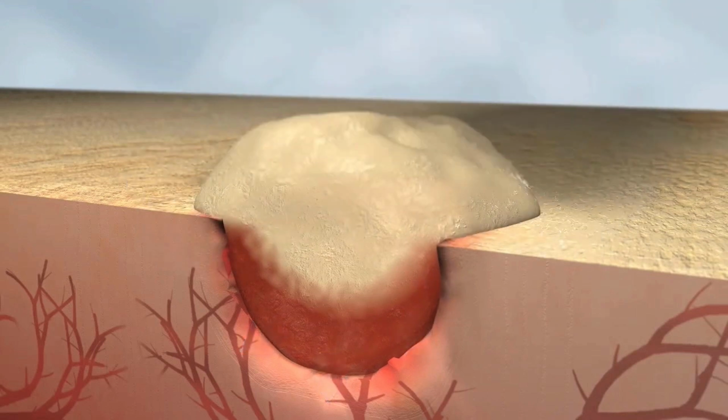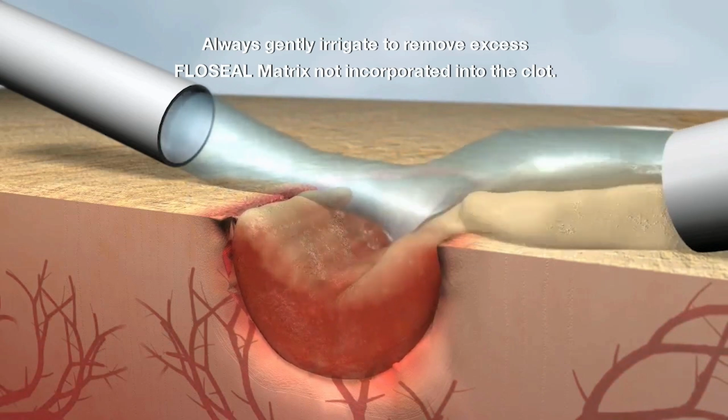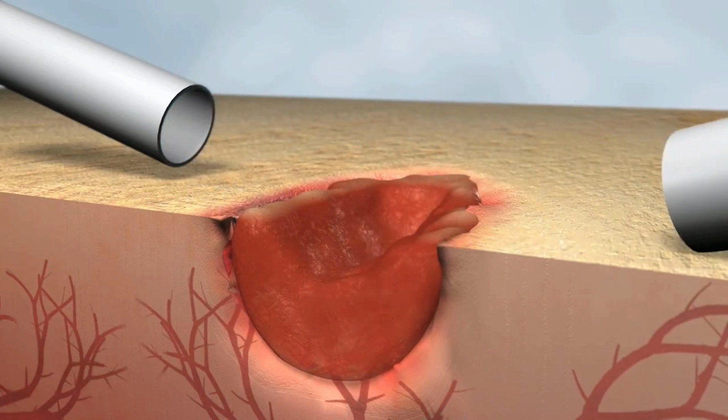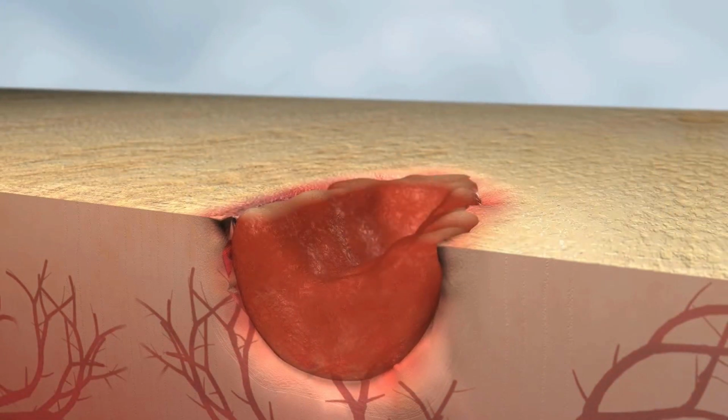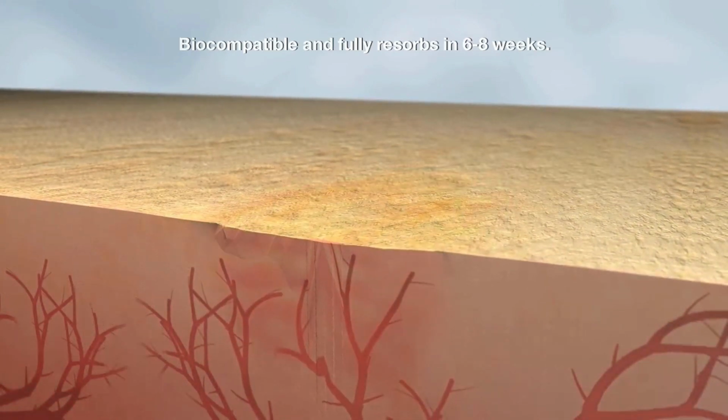Once hemostasis is achieved, gentle irrigation should always occur to remove excess product that has not been incorporated into the clot. Do not disrupt the clot by physical manipulation or suction. FLOSEAL allows visualization of the surgical site both during and after application. Biocompatible and fully resorbs in 6 to 8 weeks, consistent with normal wound healing.